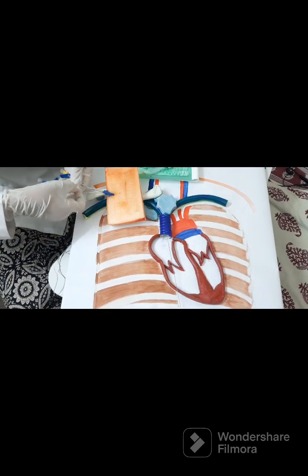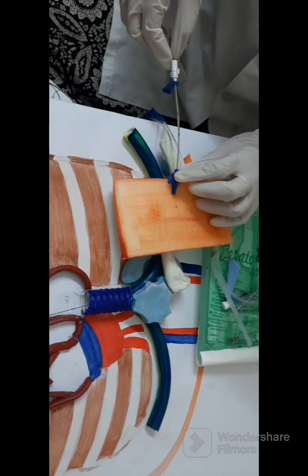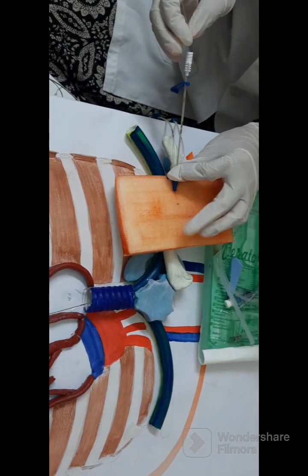Once this central line has been inserted, then we will remove the guide wire. Now we will remove the guide wire.